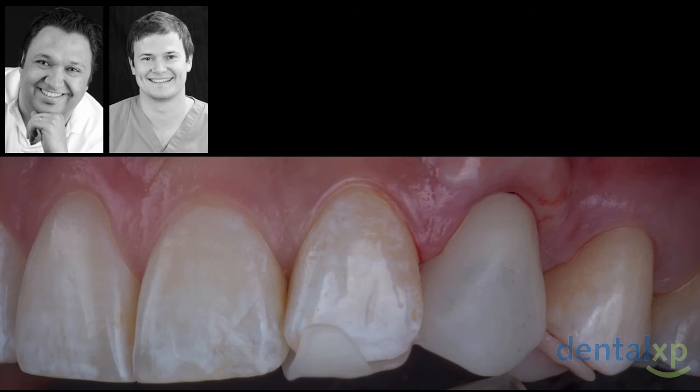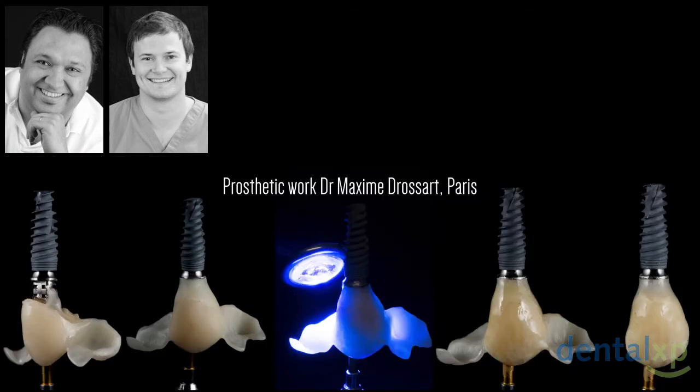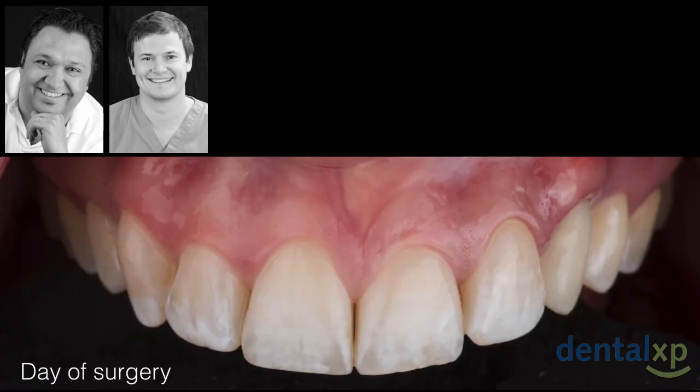And here we are trying on our temp shell. You can see it's PMMA, and the adaptation with the wings is very nice. That way we can position it exactly the way we want. If there is some trimming that needs to be done, it's the stage to do the trimming to fit it perfectly. Then we put a small rubber dam around the abutment, place the temp shell again and reline it. We capture it, and you can see here we used an implant as a replica. From left to right we are going to add acrylic to manage the emergence profile as we like. We add the xenograft material, and here we are ready to introduce our temp shell. And this is how the patient left on the day of the surgery. You can see that it's very satisfactory.